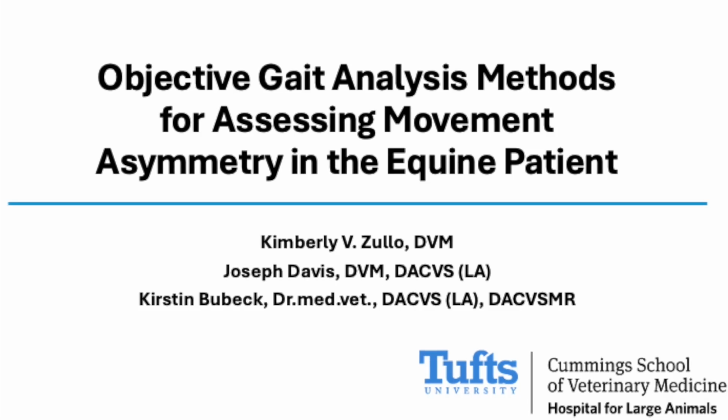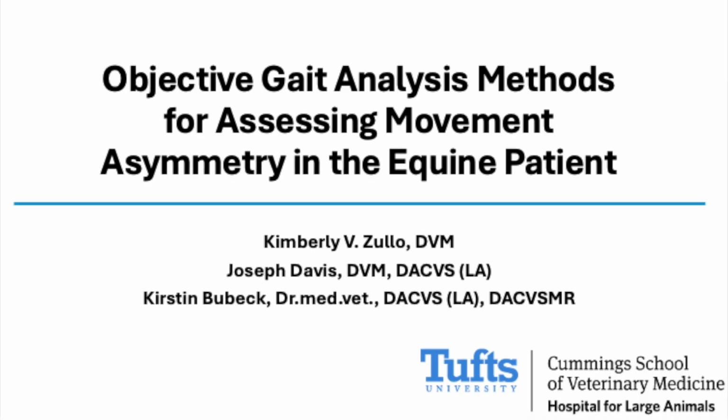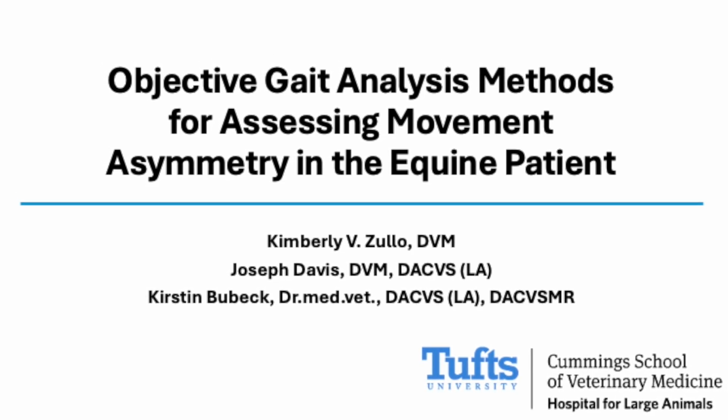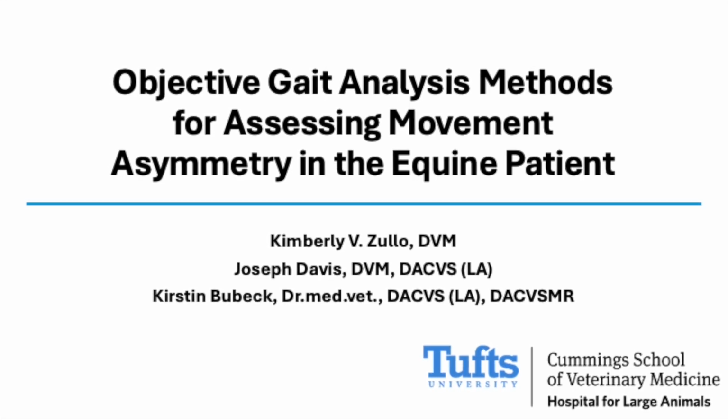And welcome to this technical tutorial video. Today we will demonstrate the use of objective gait analysis methods for the assessment of movement asymmetry in the equine patient. We have no conflicts of interest to declare, and informed owner consent was obtained for all animals in this video.